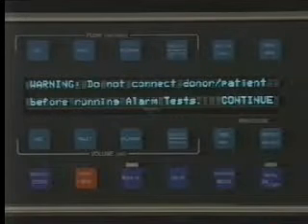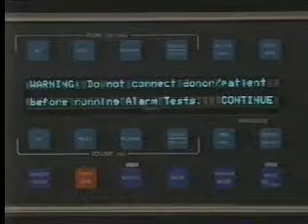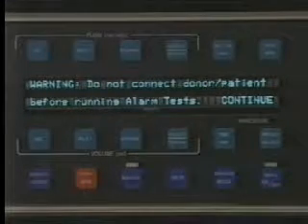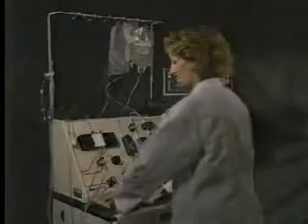You know that you have completed all of the loading and priming steps correctly when the system gives the following warning: Do not connect donor-patient before running alarm tests. Let us now take a look at this procedure without interruption.